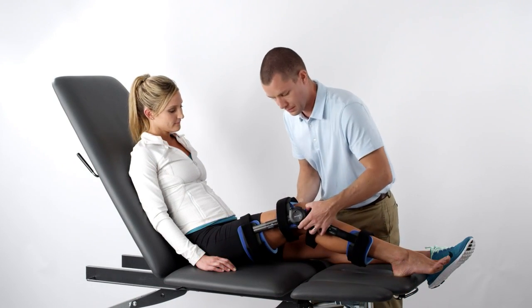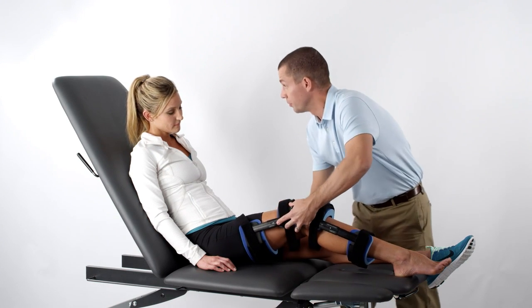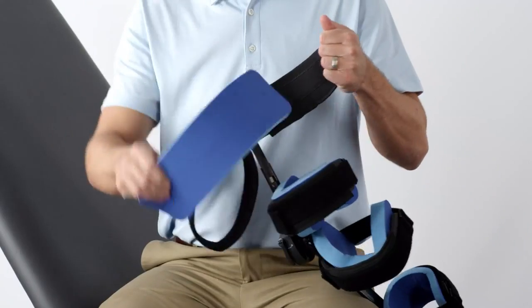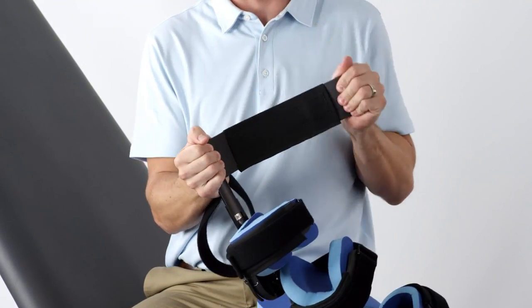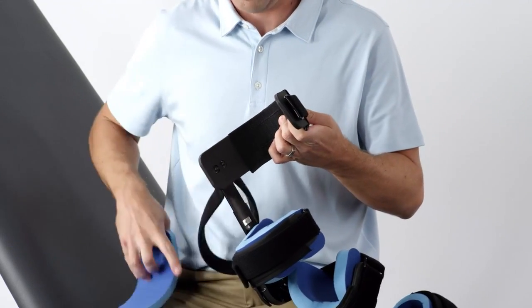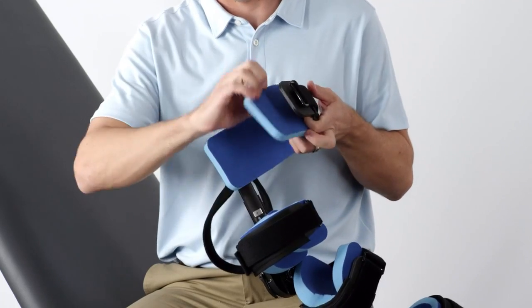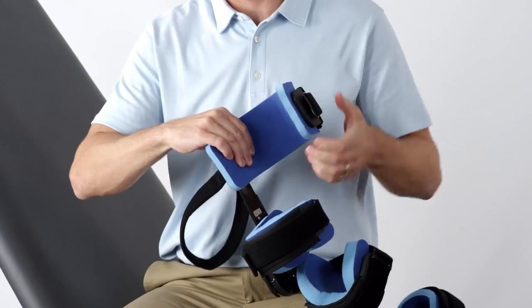After the struts have been properly adjusted, shape and mold the bendable contour cuffs to the patient's limb to assure a snug yet comfortable fit. Advance's unique contour cuffs are made of an aluminum insert and rubberized coating that enable you to easily bend and twist the cuffs. The blue memory foam pads, which are attached to the cuffs by Velcro, may also be repositioned or trimmed and sized to maximize fit and comfort.